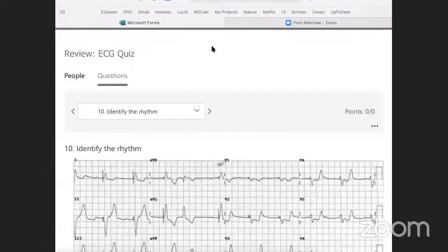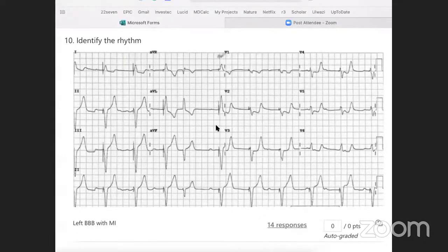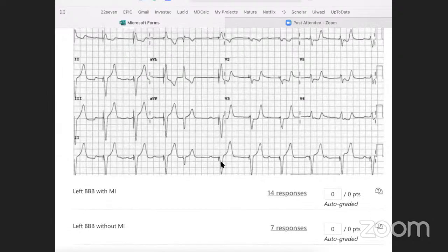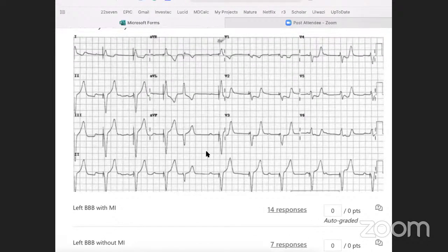Right, next ECG. So this ECG, I didn't give you history because really ECGs are beautiful and they can tell us so much more than what we interpret from them. And key to this ECG is that there is a pacemaker here. So there is a ventricular pacemaker.